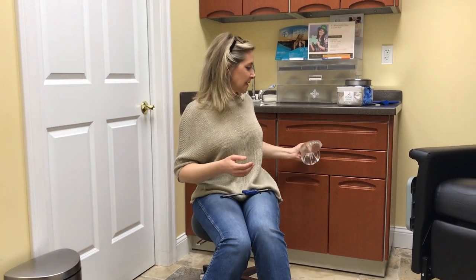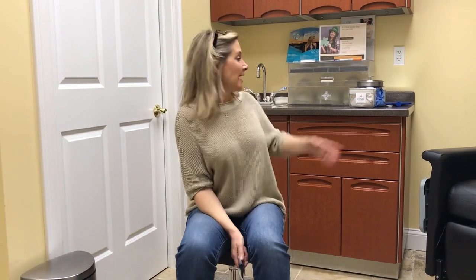So when you're coming in for your sizing, I ask people to wear a sports bra without any padding in it. And I have these sizers that they put in their sports bra and put their shirt on and look to see a general size of what they're going to like. I can tell you the vast majority of people are somewhere in the 300 to 400 range in my practice. 350 I think is the national average of a moderate plus profile implant, but there's hundreds of different sizes and profiles. So trying out the size is really catered to you, and in my practice is to decide what size that implant is going to be before you even go to sleep in the operating room. You're going to know what size you're getting.